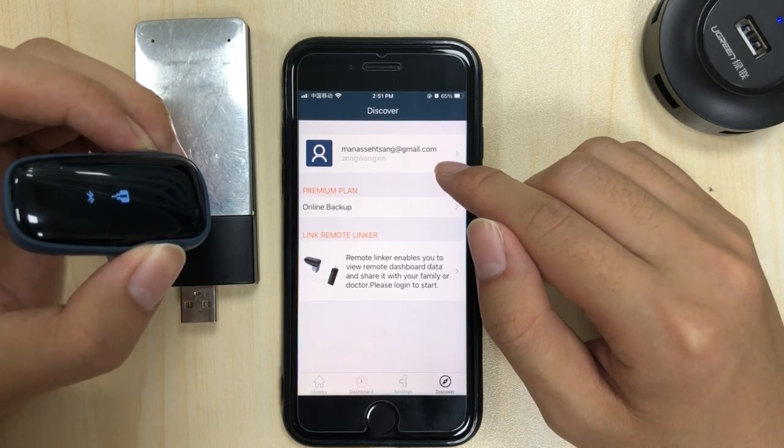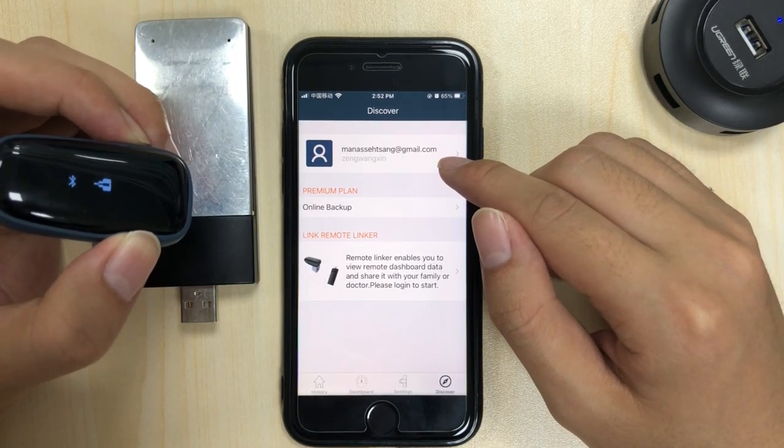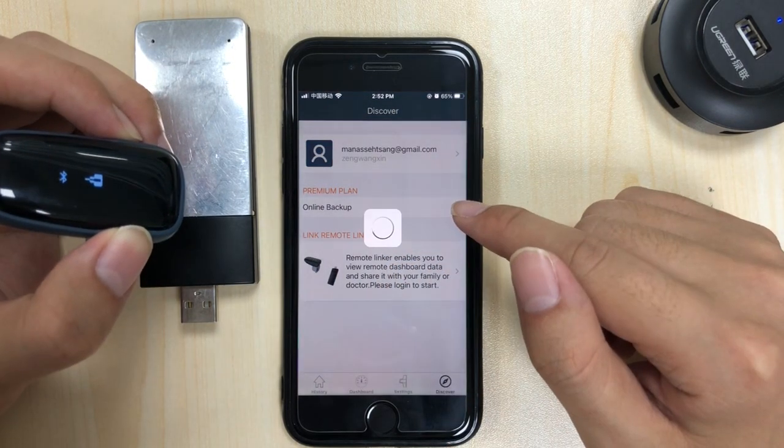Now you need to get an account — if you don't have one, sign up for one and log in. Then tap here to enter the remote link.